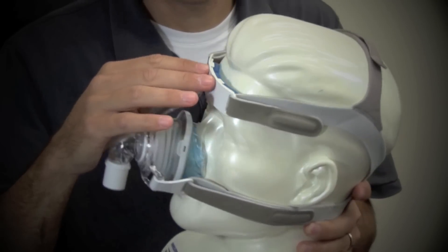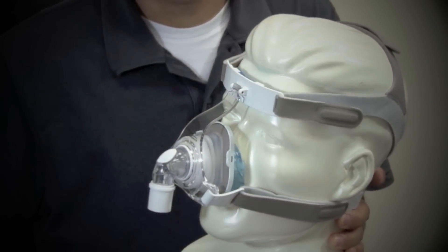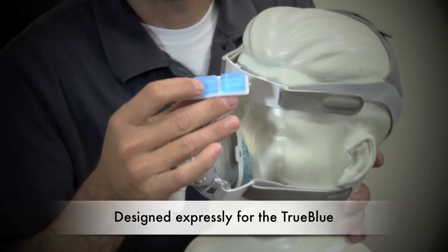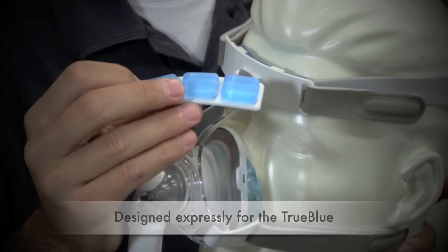There's the forehead pad up here. There's a little pin in here which helps it pivot. And here's the forehead pad right here on the underside. It's remarkably soft — gel pads. There are three little gel pads.